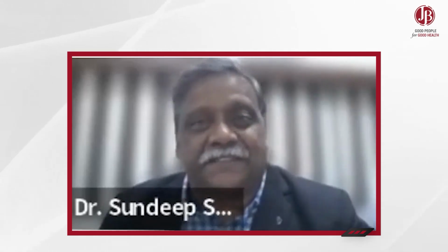In severe or very severe obstructive airway disease, this is the shape of the curve. Okay, so what has happened to this? FEV1 value is significantly low. FVC value is also low over here. And there's a line that seems to be going up and up forever. Low FEV1, low FVC, and a line that keeps on going up and up forever is severe obstructive airway disease. Isn't that simple?